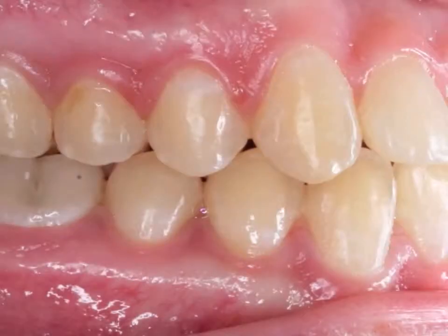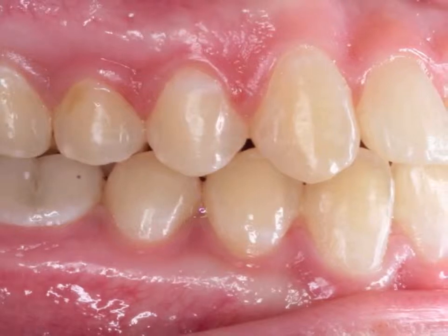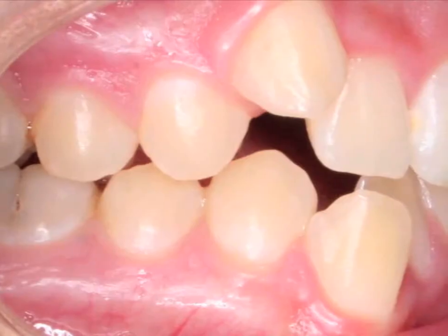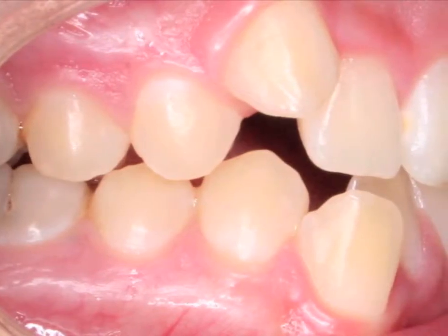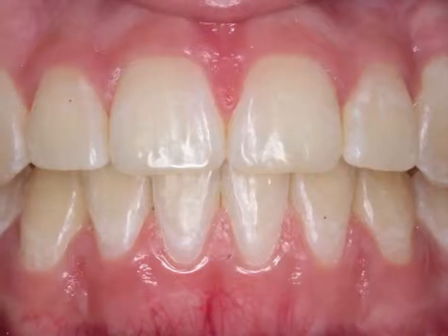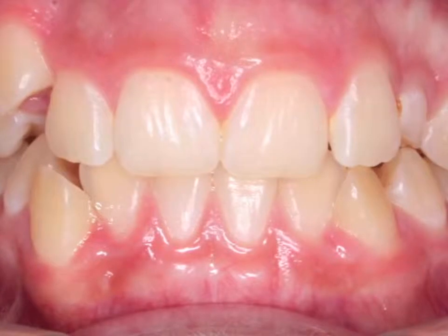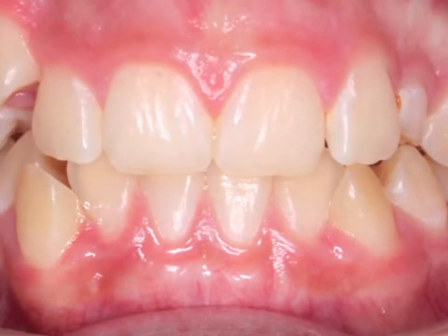The importance of precision bracket placement is based on several principles that will be outlined in this video. The tip of the first bicuspid will approximate the edge of the central incisor, as first described by Dr. Kalangi. These before and after photos are a result of that placement technique.